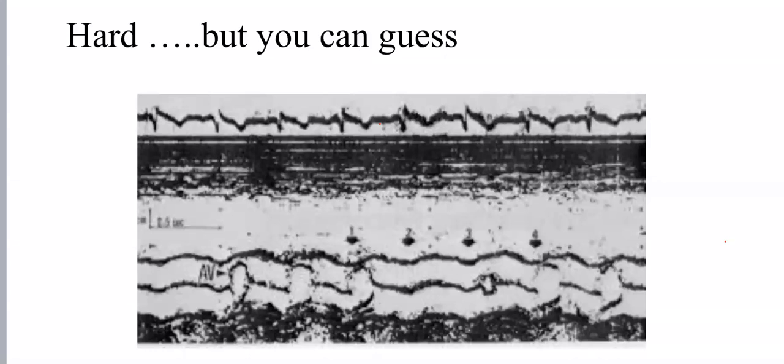Usually we don't see that one. What we see is that when I interrogate the LVOT by PW, I see variation. I still see that there is LVOT flow, but it goes low during inspiration. Here it goes so low that it is not strong enough to open the valve, or hardly opens the aortic valve. That's an extreme form of tamponade, and that was an example of tamponade.